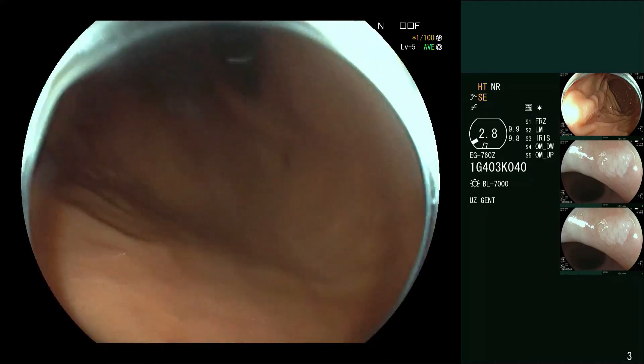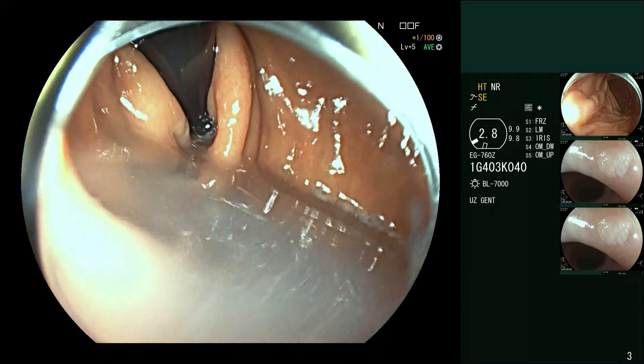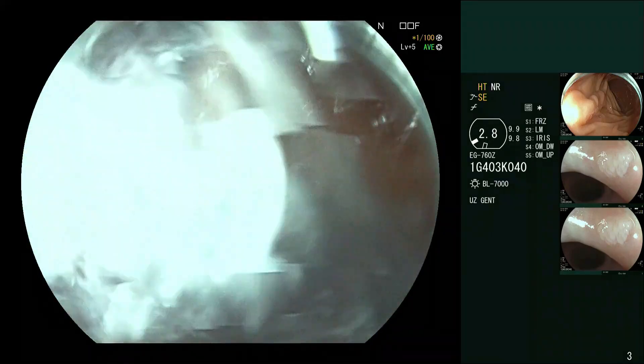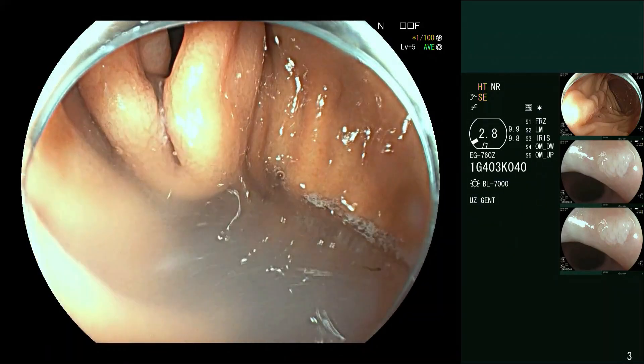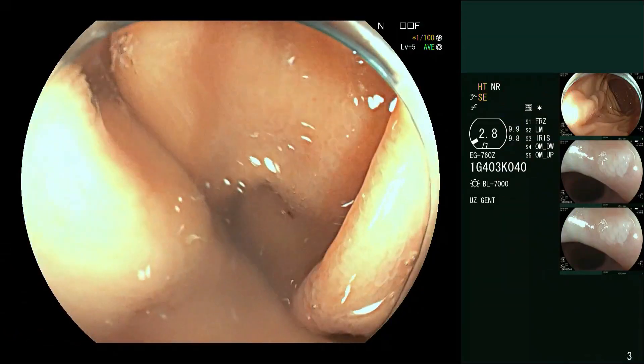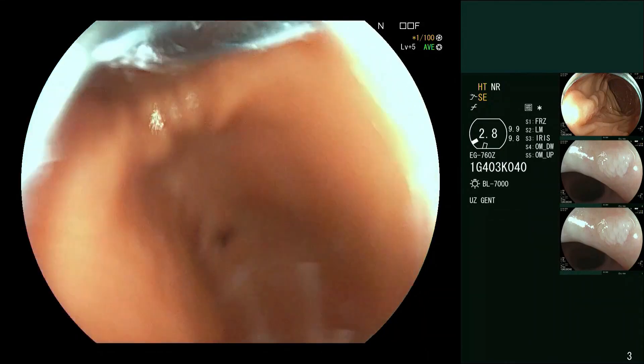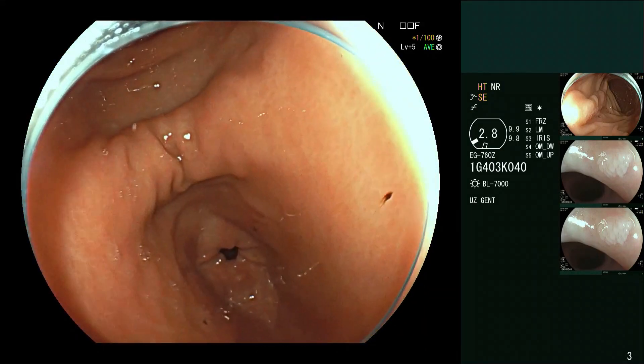As soon as you put that simethicone in, you also want to be sucking it out if your patient is not intubated or is awake, so that they're not aspirating it. You can see quite clearly how open the lower esophageal sphincter is here — that's just going to reflux all the way up if the patient has no obvious gag reflex and can cause nasty aspiration if you're not careful.